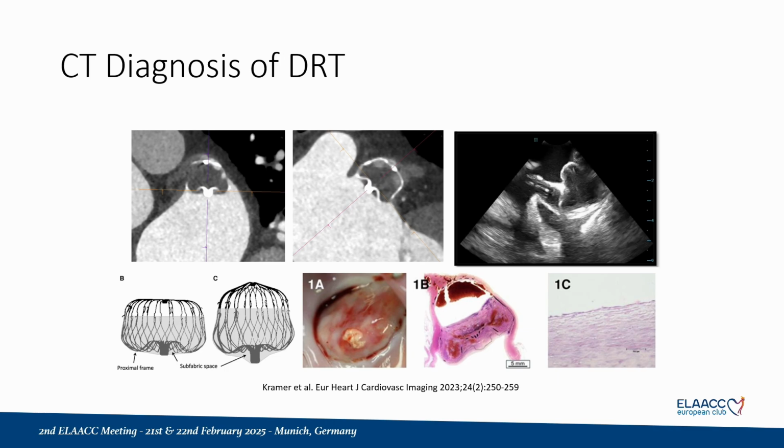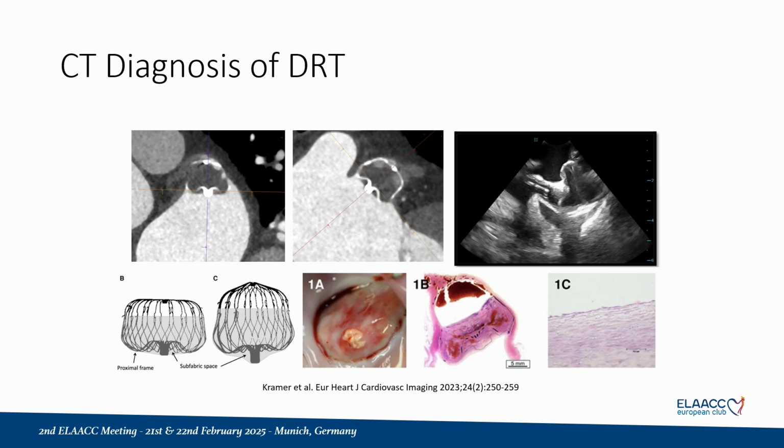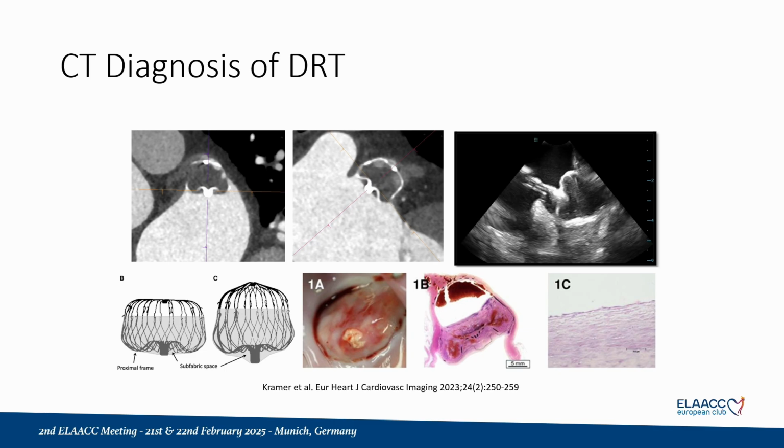We cannot see that on CT, so when you look at the two CT images in the left upper corner, you see hyperattenuation that could be considered to be on the surface, but in fact it's underneath the membrane, so it's intra-device. We've also seen that in animal studies, as you see in the right lower corner.